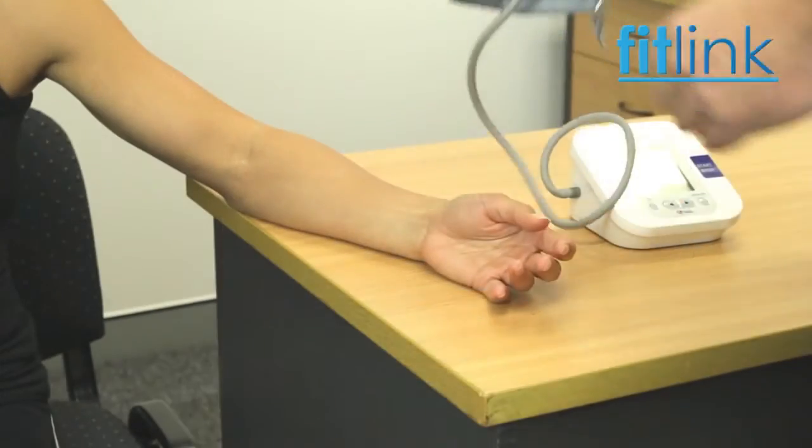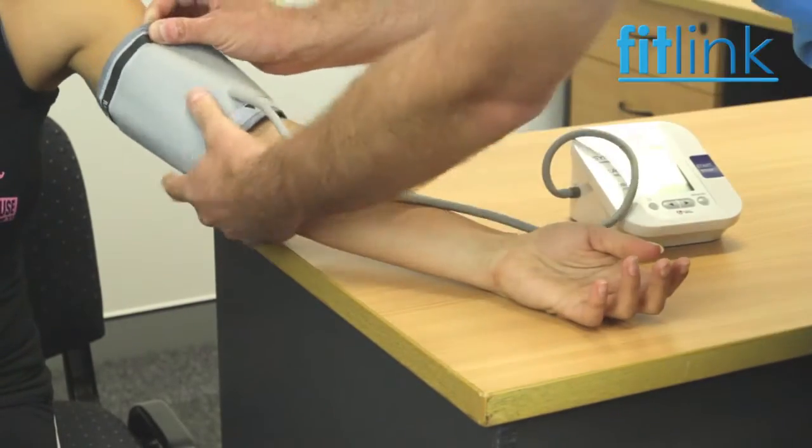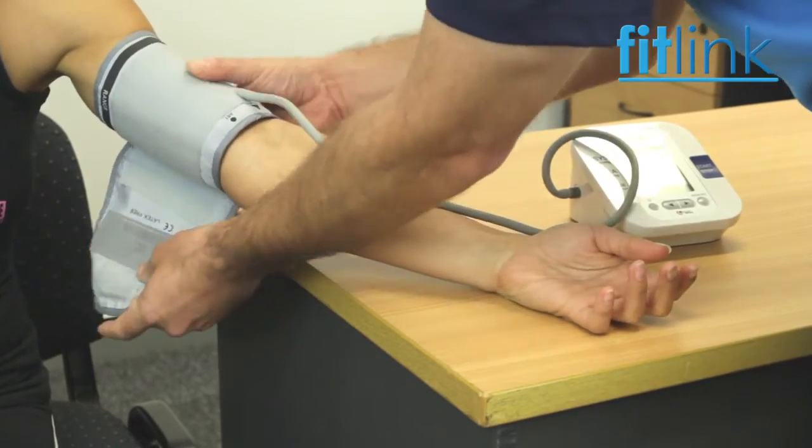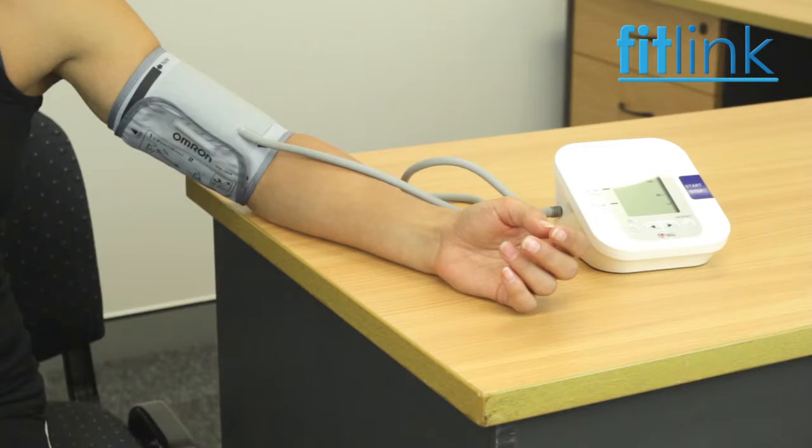Or have recently exercised. Place the cuff on the client's arm with the tube sitting on the brachial artery and running down their forearm. Secure using the Velcro fastener and press the power button. Wait for a moment and the monitor should display a zero.